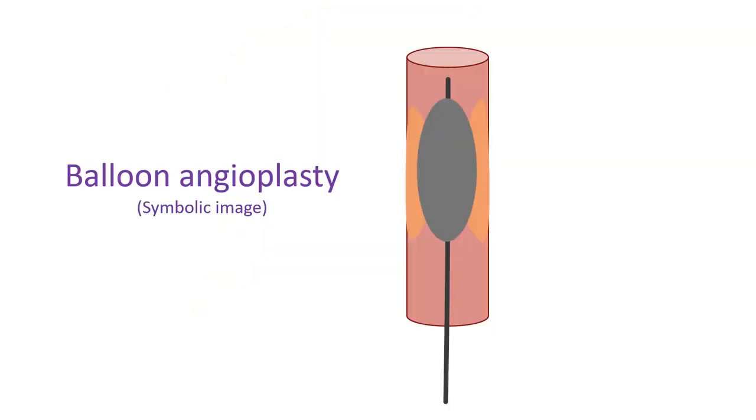Carbon dioxide angiography has also been used to guide angioplasty procedures within the tummy and in the legs. Angioplasty is removal of blocks in blood vessels using balloons attached to thin tubes. Some complications have been reported with carbon dioxide angiography due to formation of vapor lock within the blood vessels. Bleeding at the blood vessel puncture site can occur in carbon dioxide angiography as in conventional angiography. This is prevented by giving good compression after removal of the injecting device.